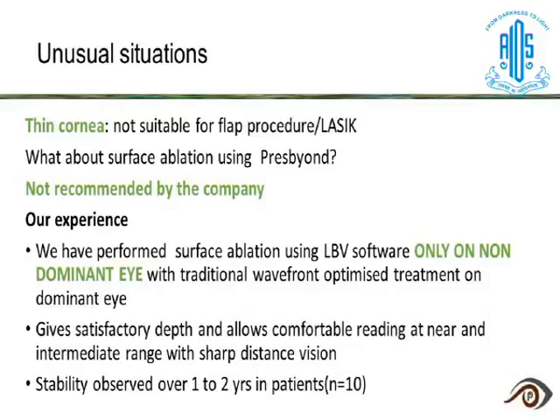Just in the non-dominant eye, we have used the same software and created 1.5. They enjoy distance as well as intermediate vision and are maintaining it. In the dominant eye, we have kept a regular wavefront optimized treatment and made them emmetropic because it's a surface ablation. Thank you very much.